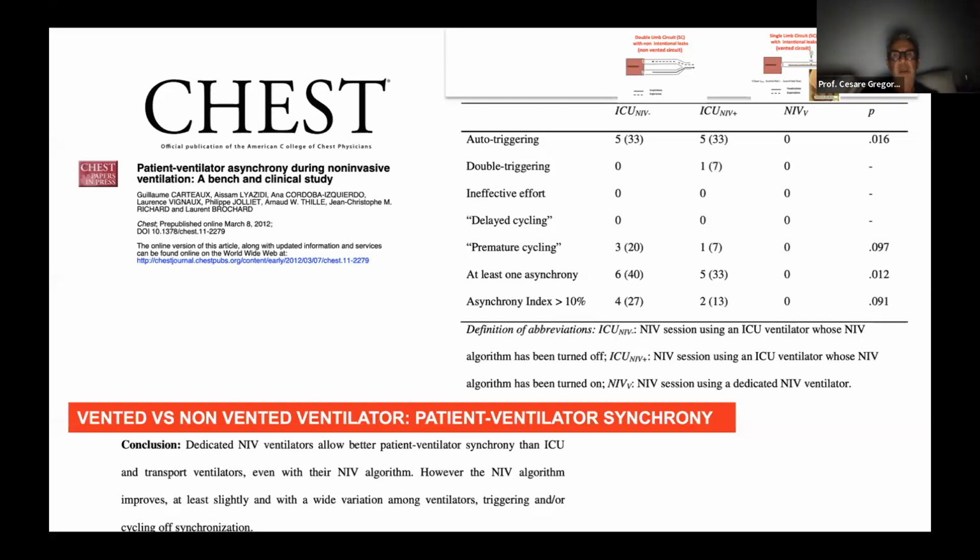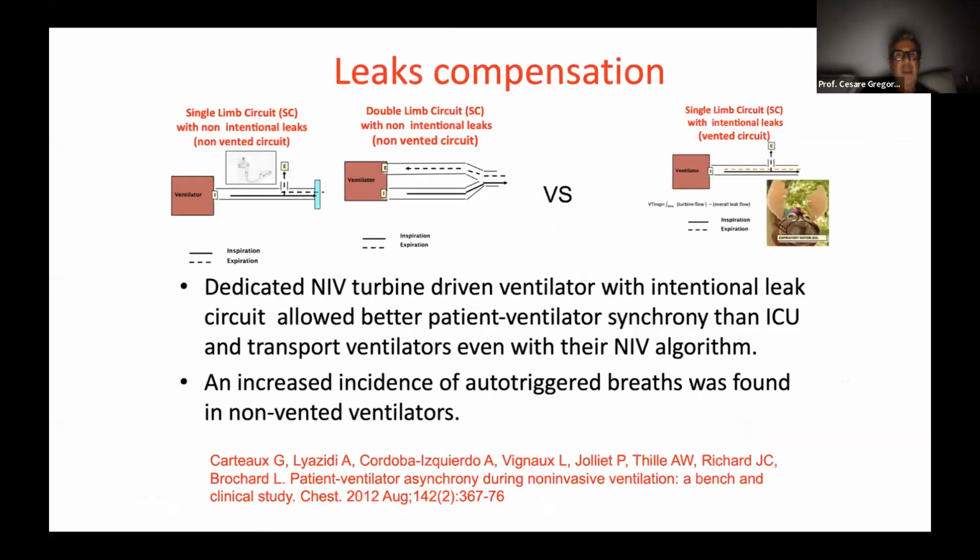What they found, the asynchrony index was 0. So the patient-ventilator synchrony was much better without a valve than with a valve. And this was the conclusion of the paper.